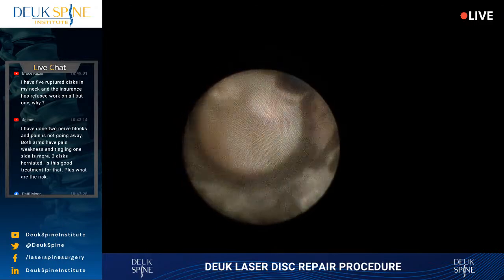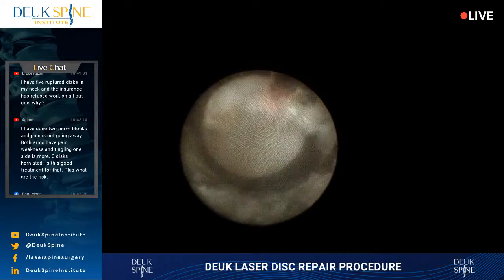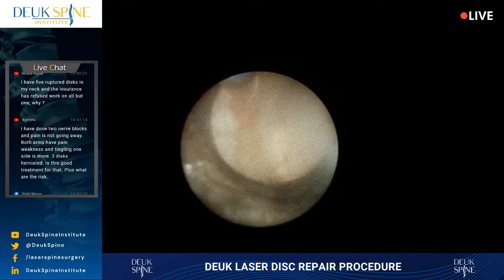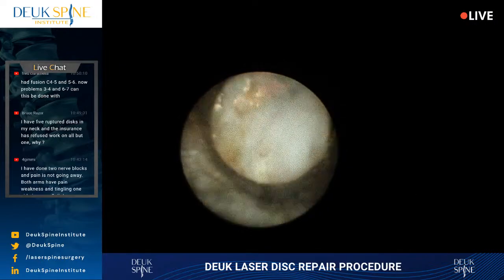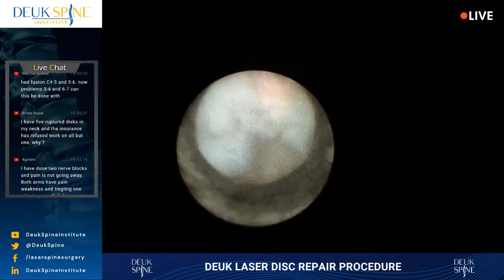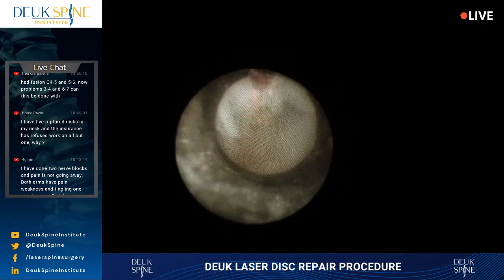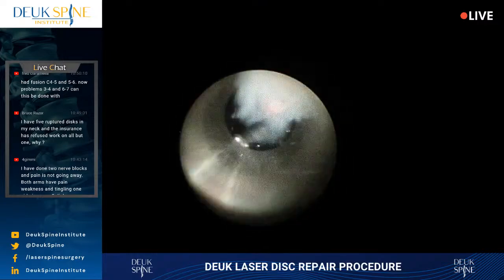Most people want to take time off for a week or 2 from work, but you could go back to work the next day if you want to. All right. So, thank you, Louise, for holding that aside. I've just got to finish cleaning this tear up here, and then we'll be done with your side of the disc. Just get all this stuff out.